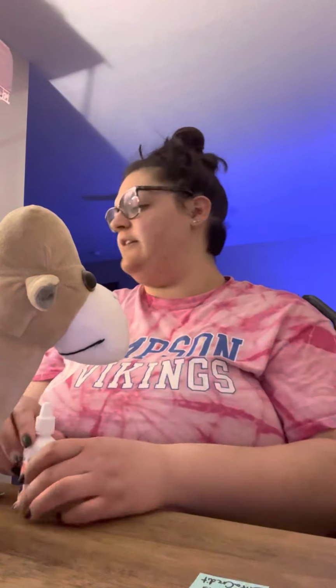Before we get started, I will also have a separate tissue with me as well. So I'll have Cam blow his nose. And I will dispose of this and keep a new one for me. So I will then clean the tip of the nozzle for him. Make sure that it's clean before inserting.